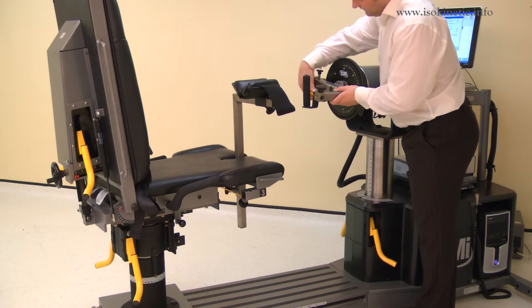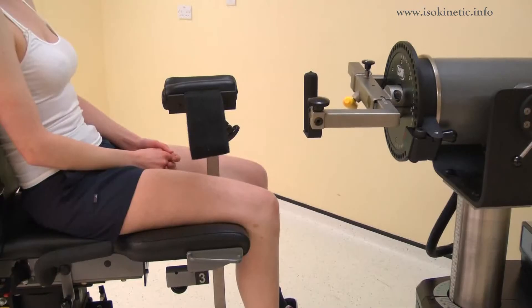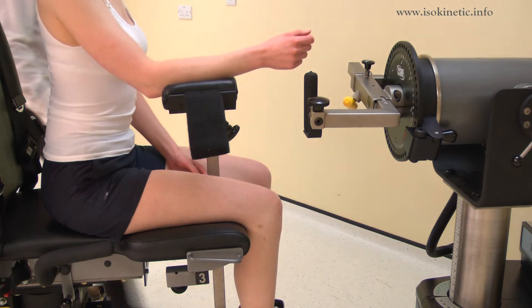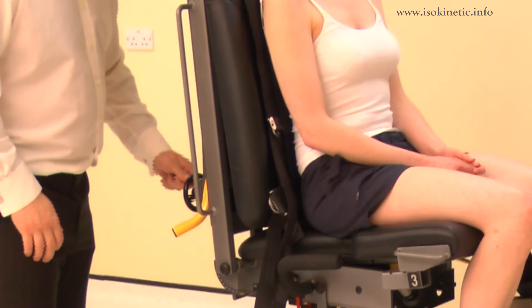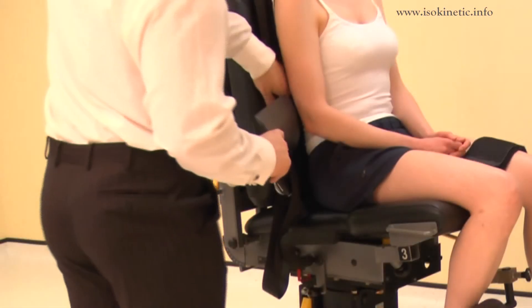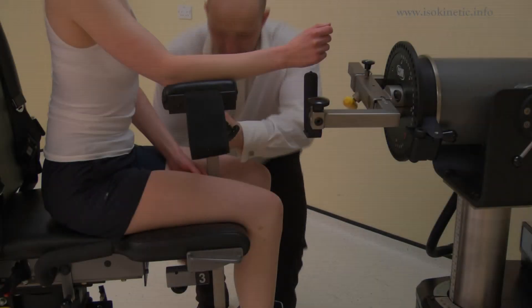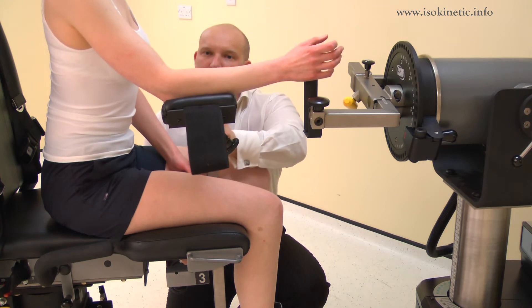Rotate the handle to position 112 by loosening the screw and rotating. Once positioned, ask the subject to sit on the chair and rest their forearm on the stabilizer. The chair back translation may be adjusted at this stage to support the trunk. Use of the lumbar cushion may be necessary for comfort.